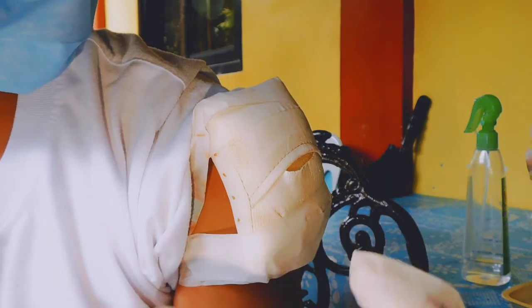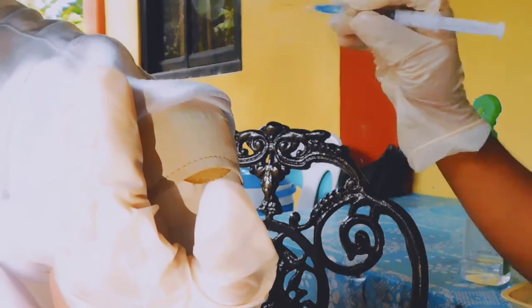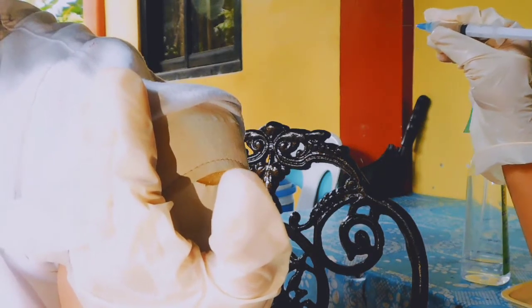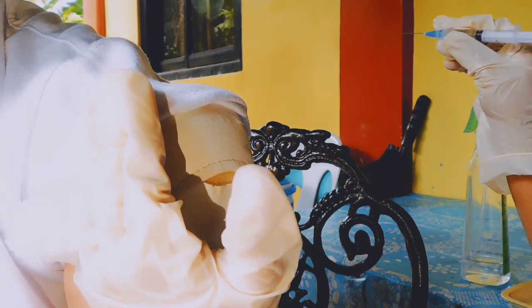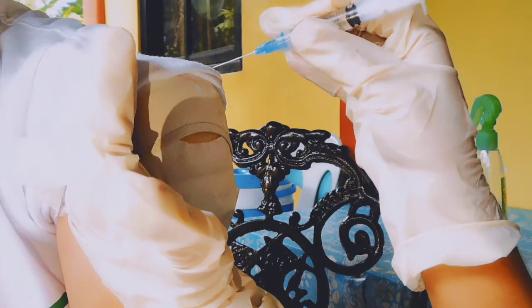Using the ulnar side of the non-dominant hand, pull the skin approximately 2.5 cm, or 1 inch, to the side. Then hold the syringe between the thumb and forefinger here, and pierce the skin quickly and smoothly at a 90-degree angle. Insert the needle into the muscle. Okay, ma'am, I'm going to inject na po.